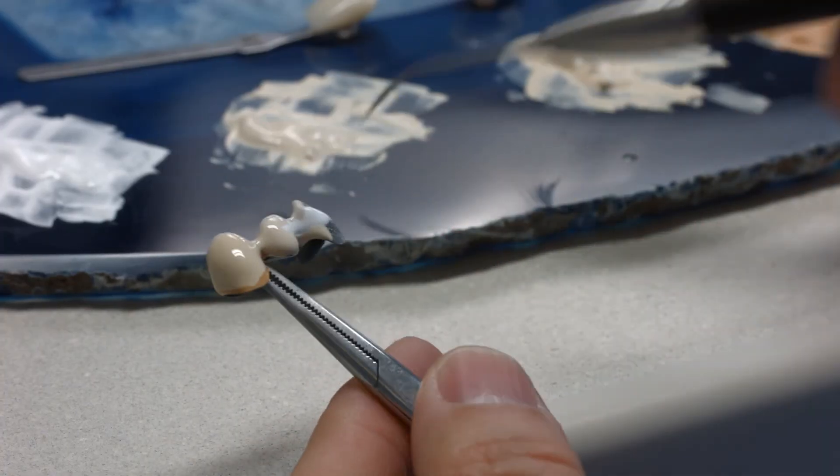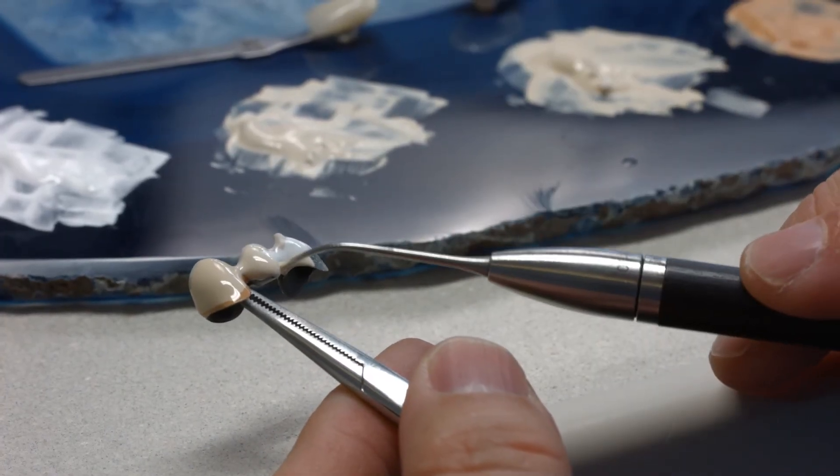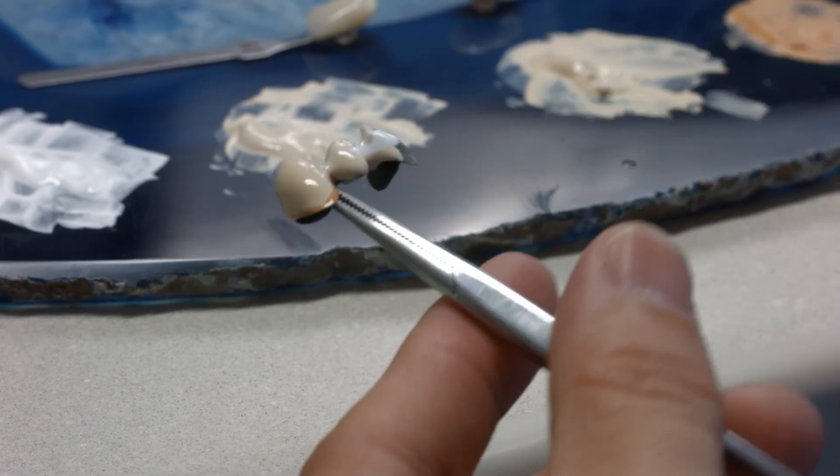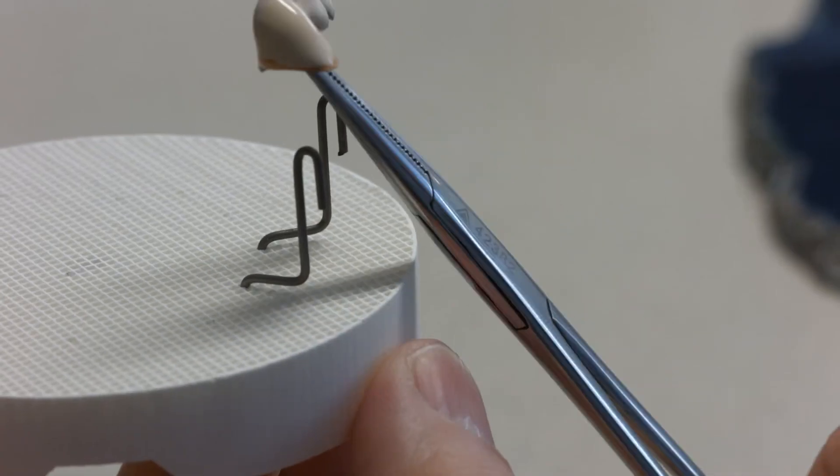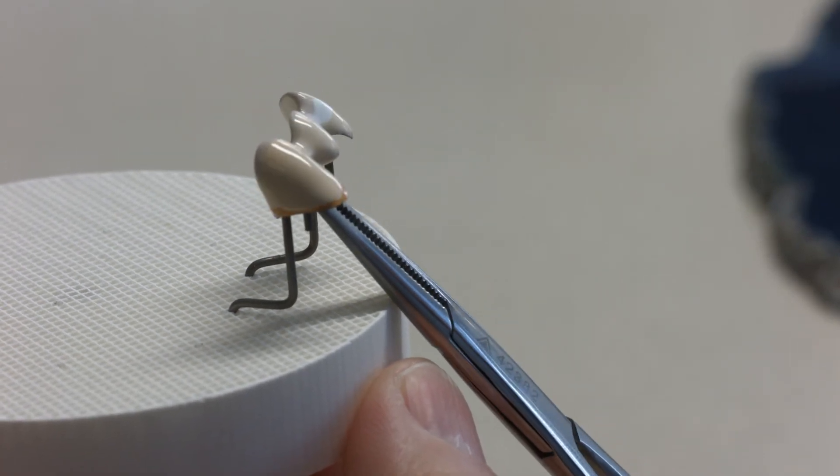If required, you can modify the colour intensity of the IPS-style powder opaquer with the IPS-style Intensive Powder Opaquer. The restoration is now ready for the second opaquer firing.